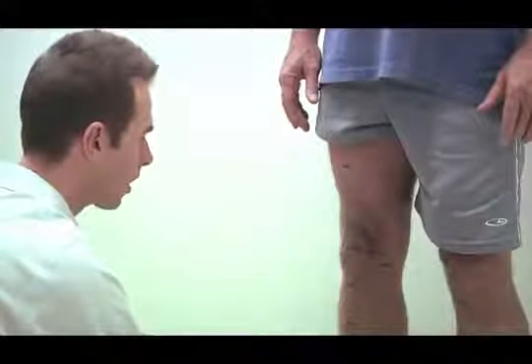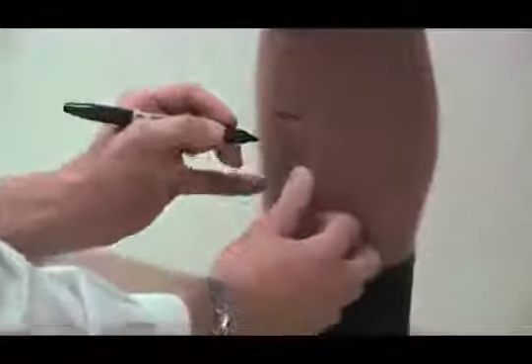Next, we want to find and mark the tibial crest. Start by finding the tibial peak just below your 6-inch mark. Also make a mark at the tibial peak just above your 3-inch mark. Connect the two.